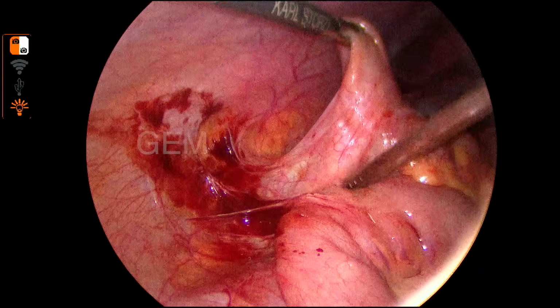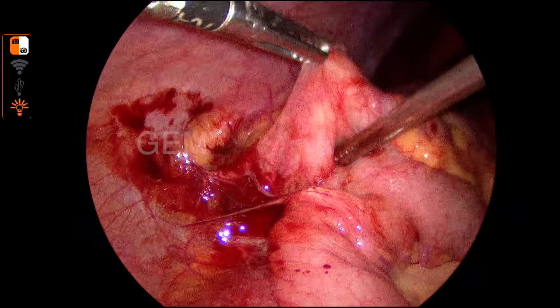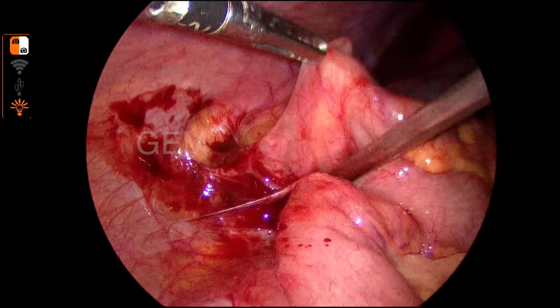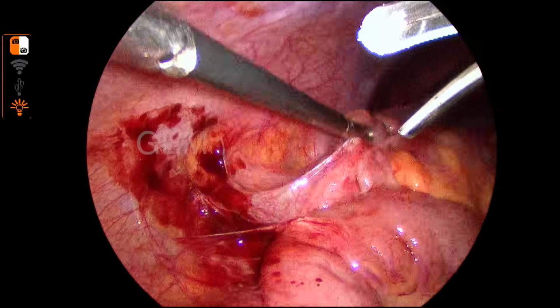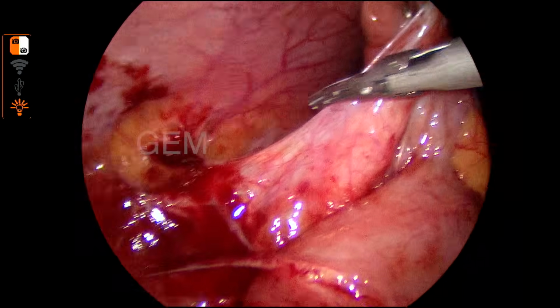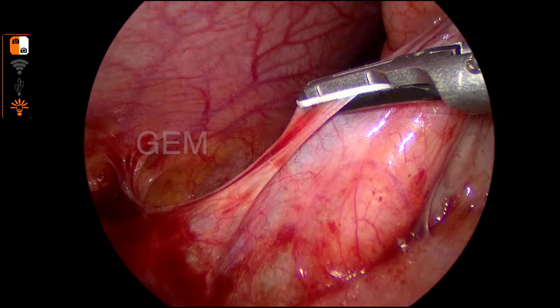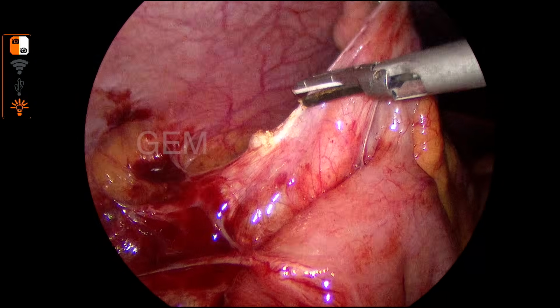So you can see the cecum is bending down. It's very clearly seen. That is the area where the cecum is bending, but by touching with the suction, it is not thick walled. So that means there is no appendix. So he started mobilizing the cecum by division of the lateral wall of the cecum, but that is not an ideal place to start the mobilization of the cecum.